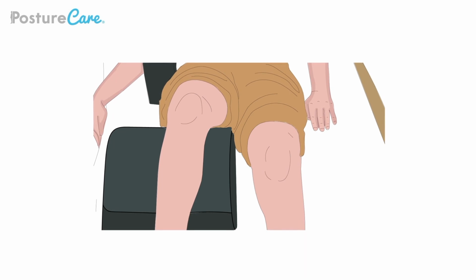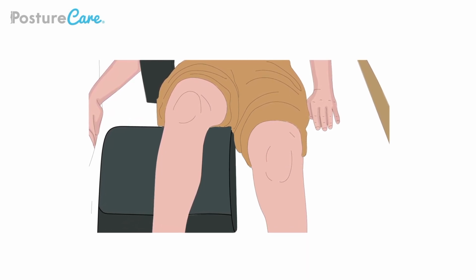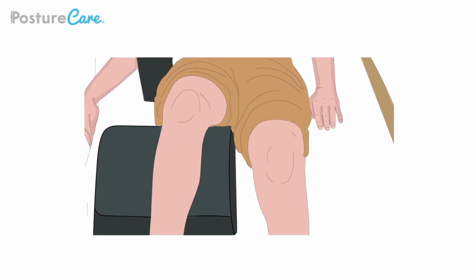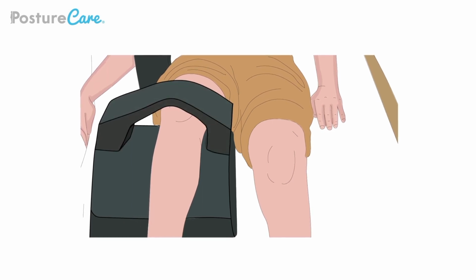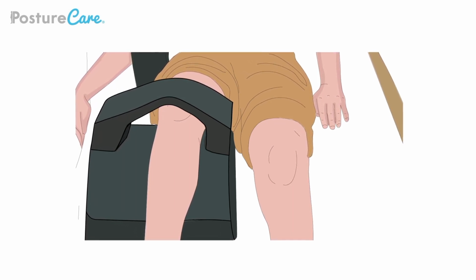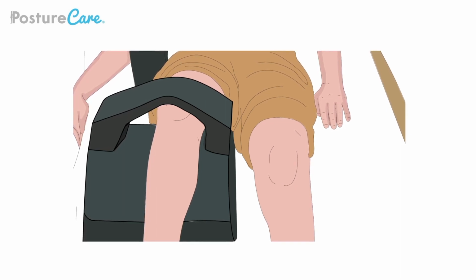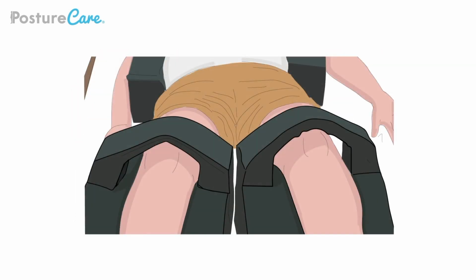Placing the blocker supports into position may require the assistance of another person whilst you support the leg off the bed. Once the blocker support is in place, secure the Velcro strap as shown. This may prevent excessive flexion of the lower limb after a cough or a spasm. It can also encourage correction when your client is adducting or abducting. If you are using the blockers for legs, you will no longer need to use the leg adjustment function if your client has a profiling bed. Please repeat the process on the other leg as shown.